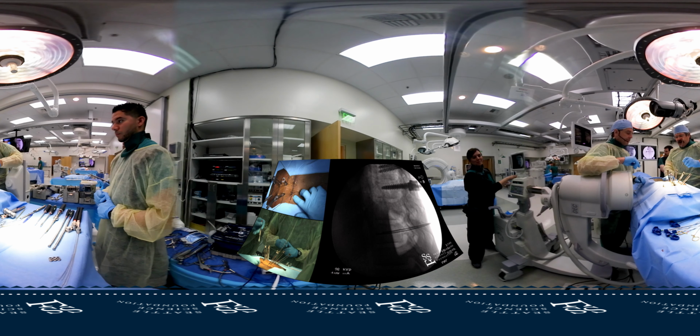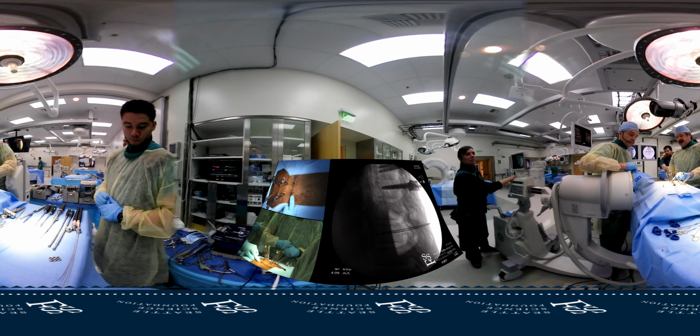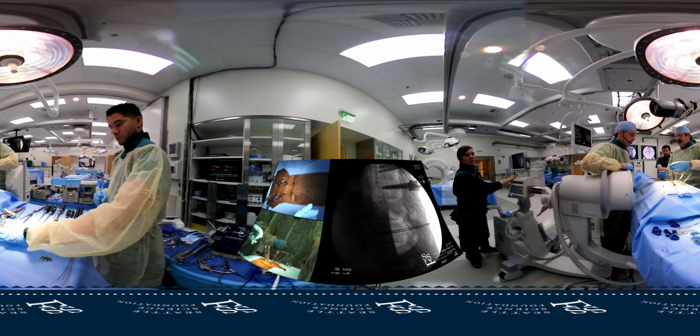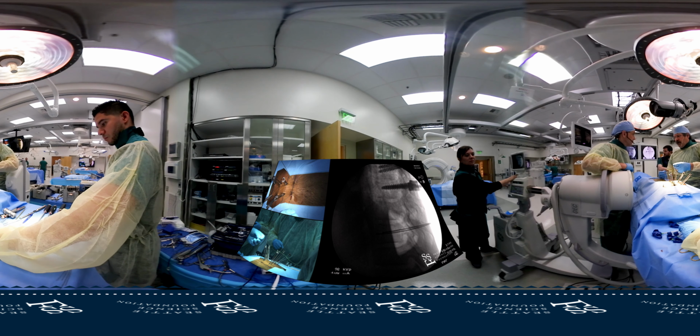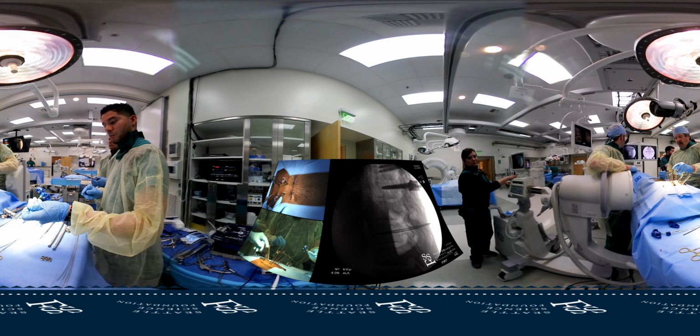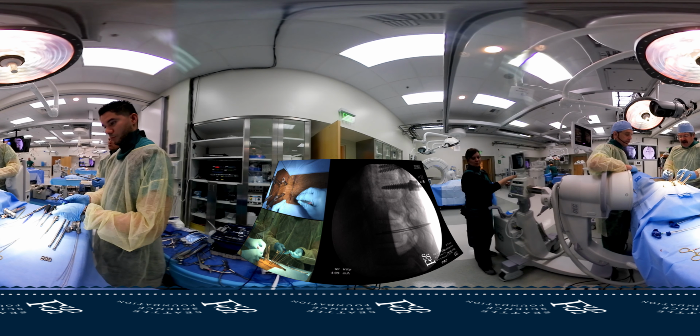So initially, I only make a stab hole. And the reason I only make a small stab is because if I have to adjust my starting site, I don't want to feel obliged to use that hole. I like to be able to make another hole. I don't want this big meandering incision.